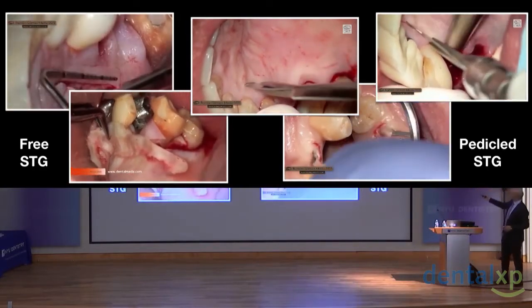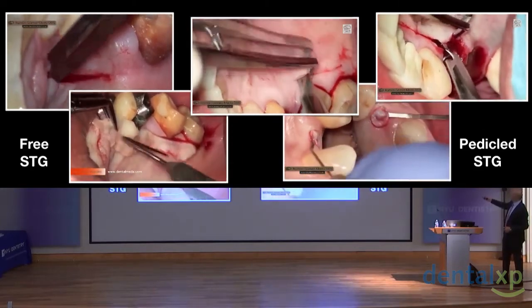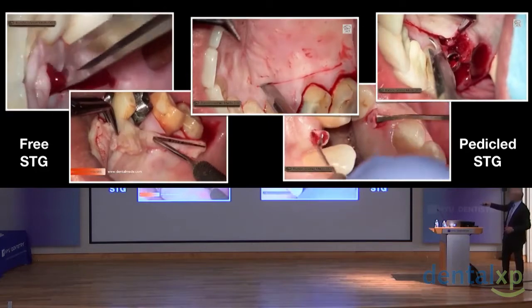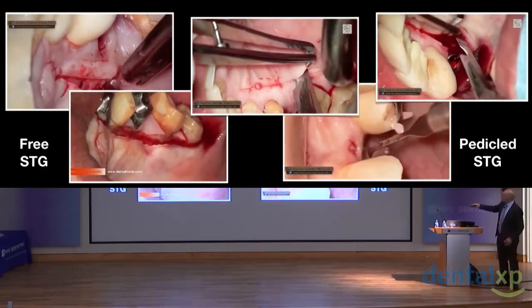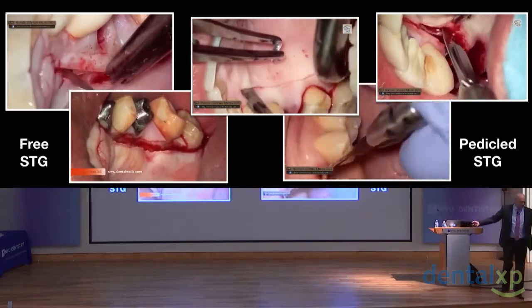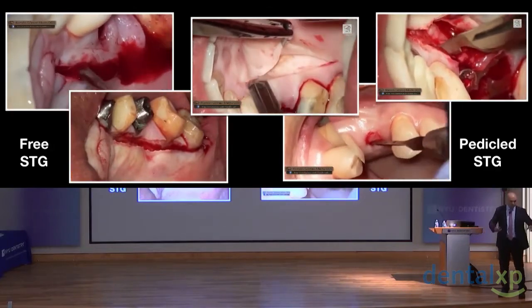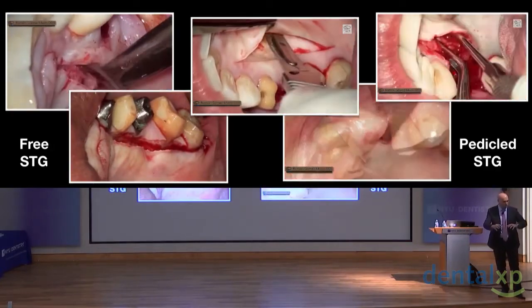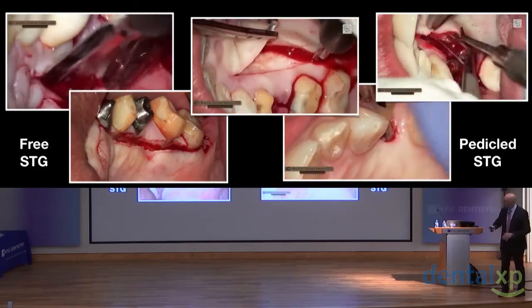You have the possibility to do pedicle soft tissue grafting techniques on the palatal side, on the buccal side, to do the classical approach, or sometimes the Bruno approach. Every case is different. I have no time to explain every situation, but I think we need different approaches and to choose the right approach for the right patient.